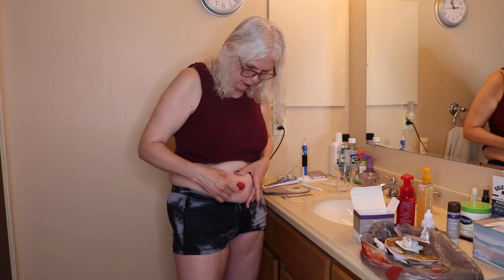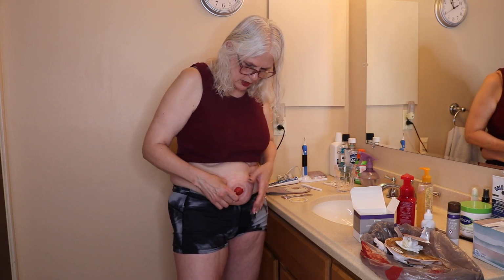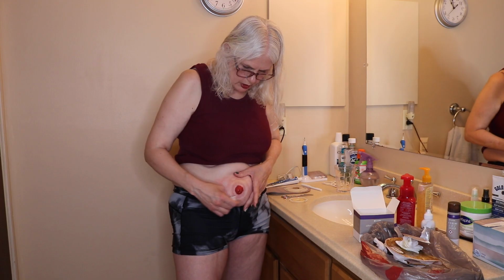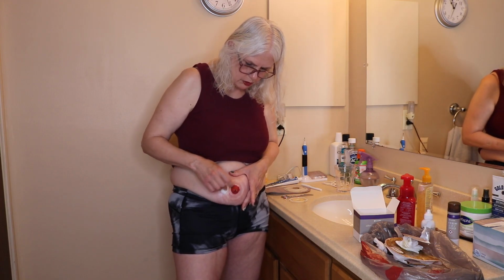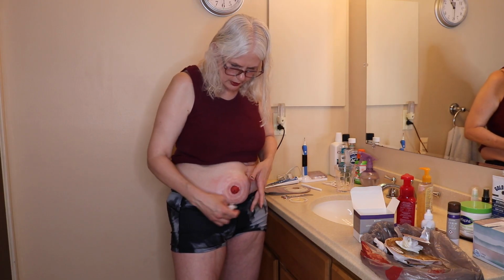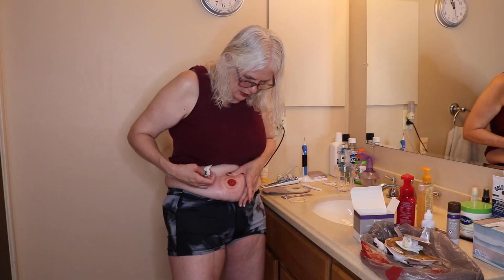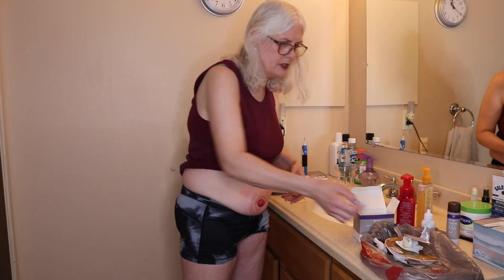So that's it. If you're just first getting your ostomy, and it could be all red and sensitive in here, you may not be able to get it completely cleaned up. Do the best job that you can. The cleaner you get it, the better everything else will stick and you'll have less chance of leaks. If you're a guy, you may want to shave this area, because if it's so hairy, the bag will have less chance of sticking well and you might have leaks.